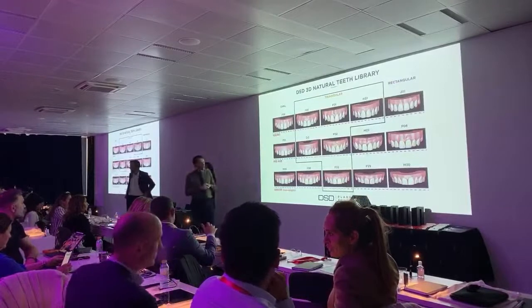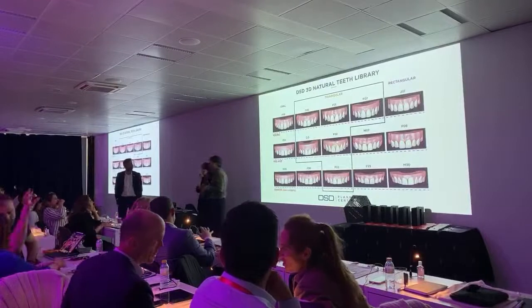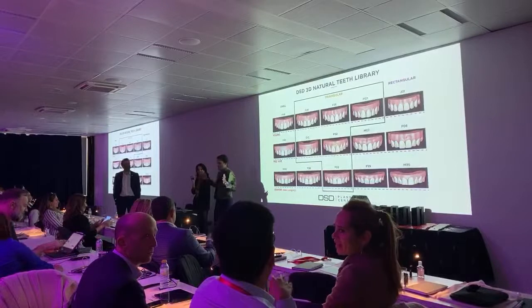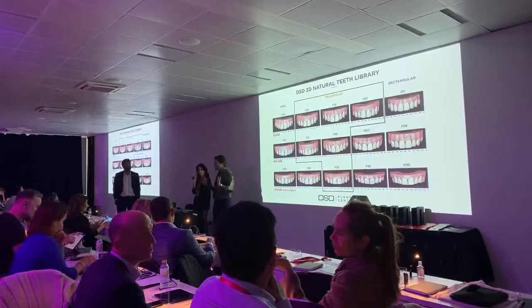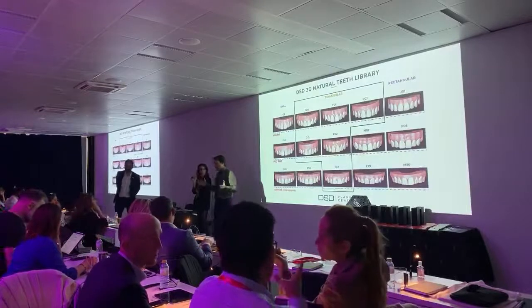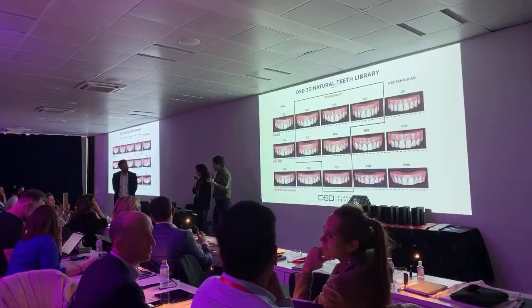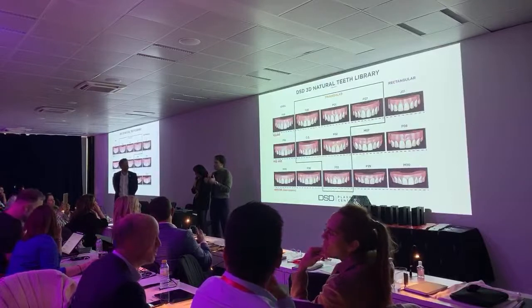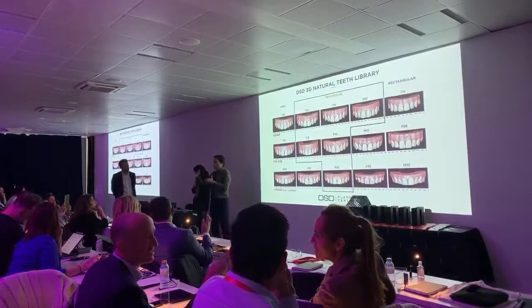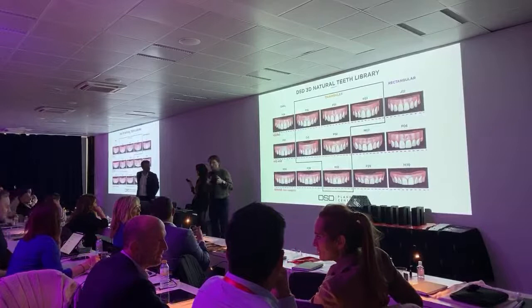This is tooth selection for smile design. Today we have basically 9 files that we use for 99% of the cases. And as we know, it's not about volume. We could have 1 million files and it's not going to make a difference. With a few files you can design almost every smile. But everybody wants to step up, and even though we know that volume doesn't mean quality, we want to grow the library a little bit. Not only grow the library, but give a little bit of meaning to this process of selection.